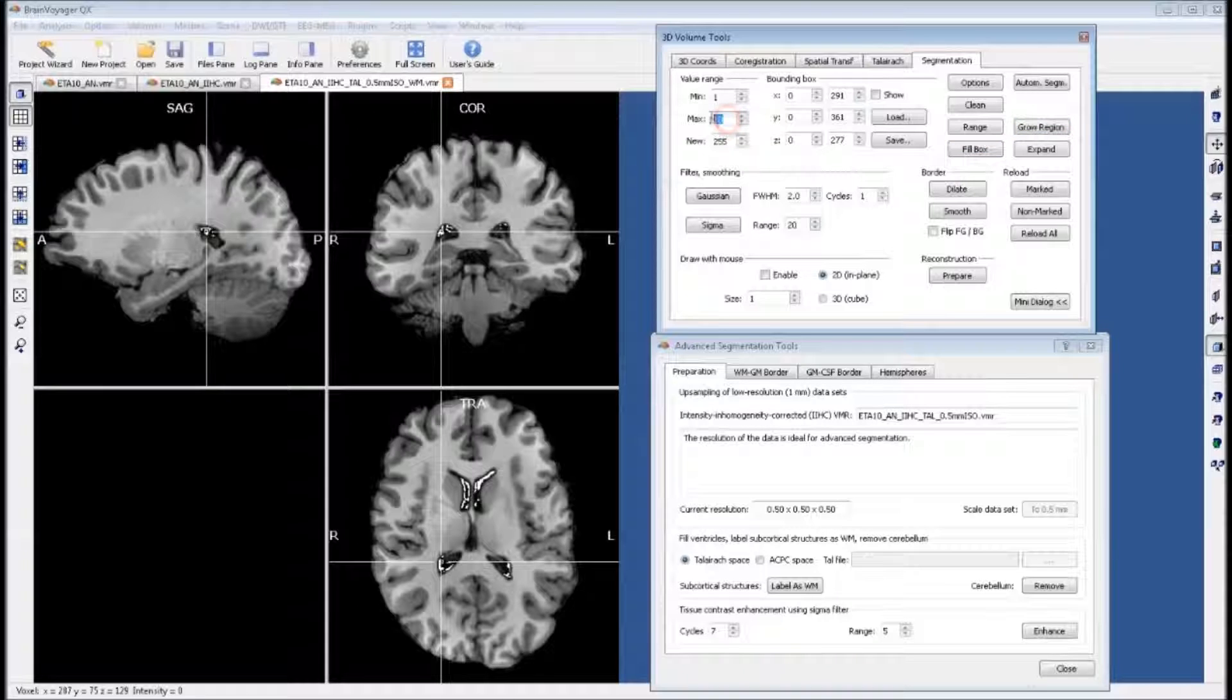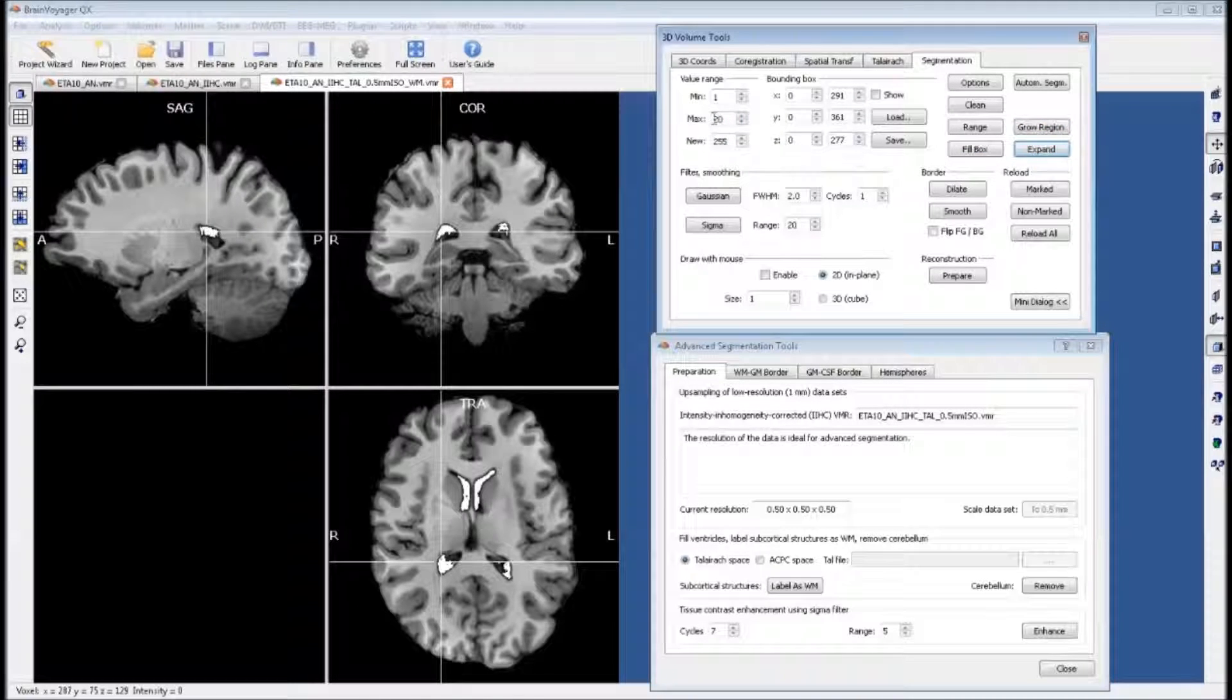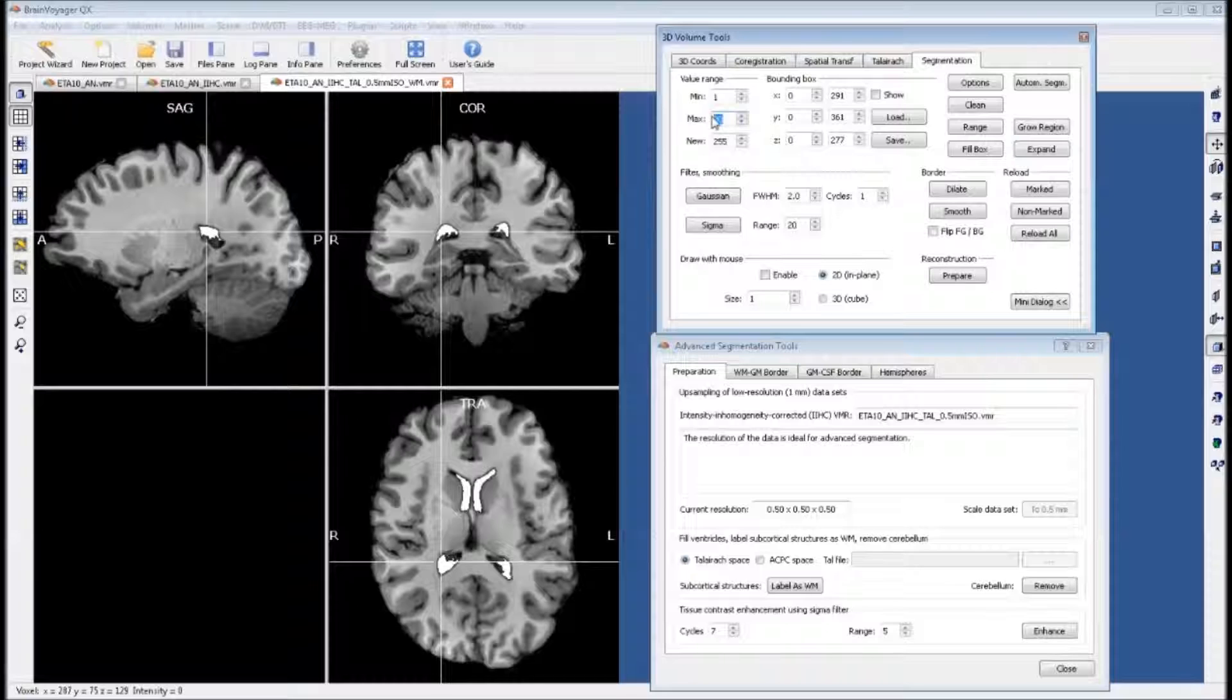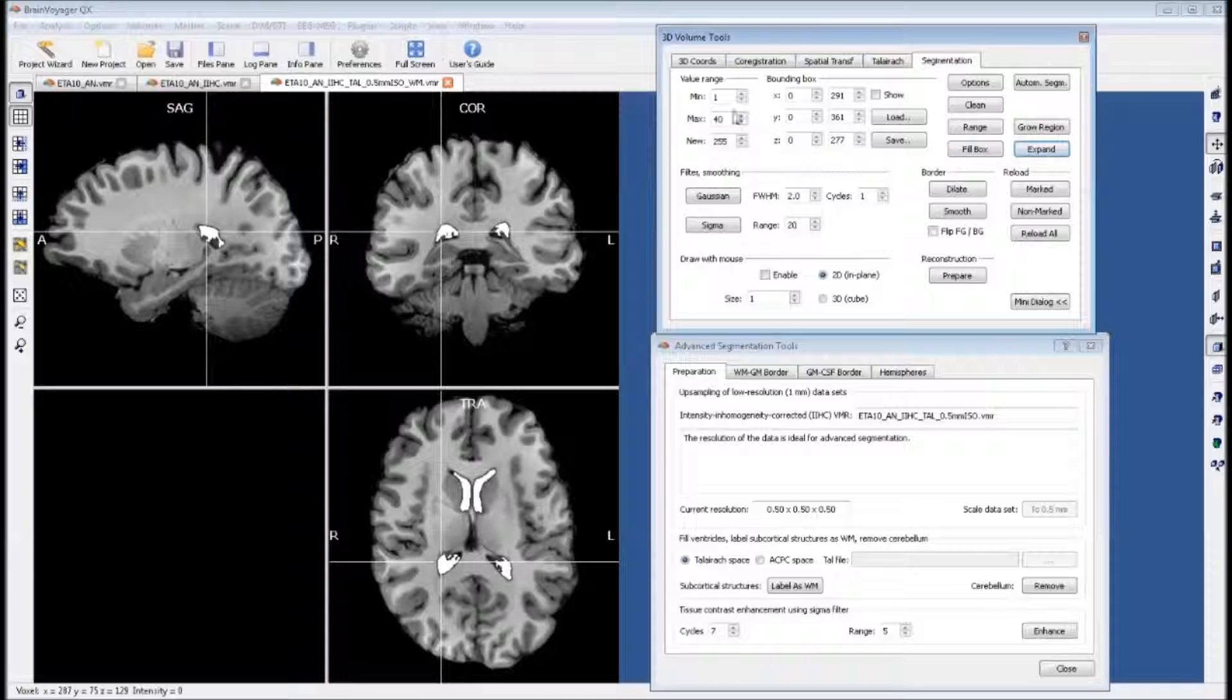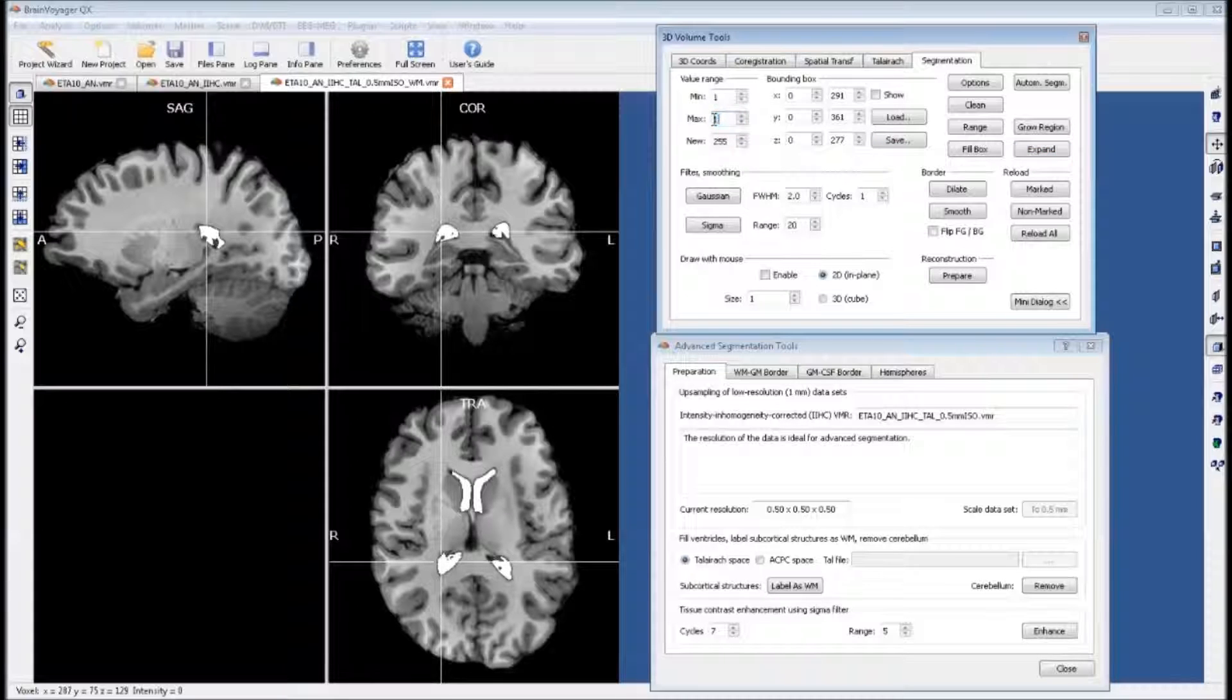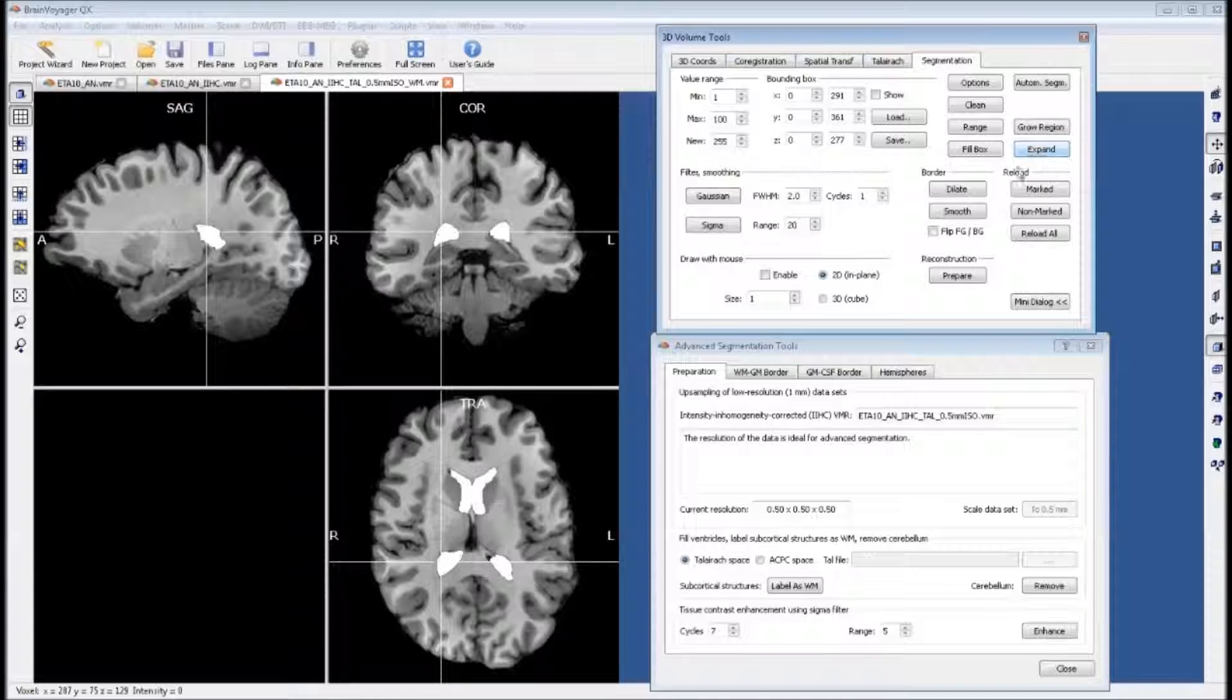When we've grown this new white color in each ventricle we want to change the maximum to 20 and click expand. This will expand this white color. Increase the maximum to 30 and repeat. Increase it to 40, expand again. Increase it to 50, click expand. Then we want to jump up to a maximum of 100 and hit expand twice. This will fill in the ventricles with this white color.